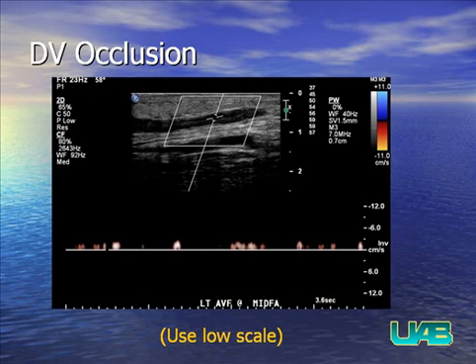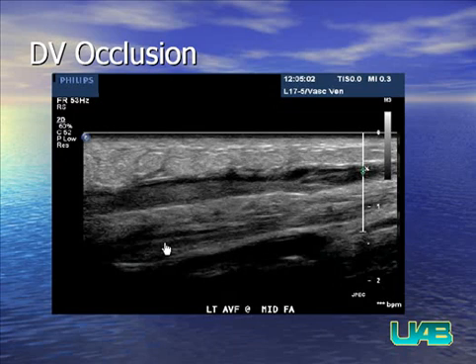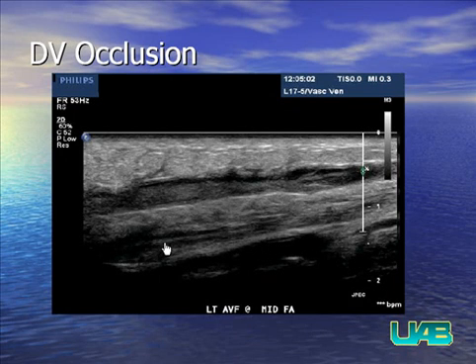Now, draining vein stenosis should be differentiated from draining vein occlusion, as we see here. When you have echogenic material filling the draining vein, this is a good hint. You do compression, it won't compress, and then if you put a spectral gate on, you may get some artifact, but really no adequate flow. And then this is just a nice video clip showing the pulsatility of the clot as it's being sort of pushed upon by the vascular flow.